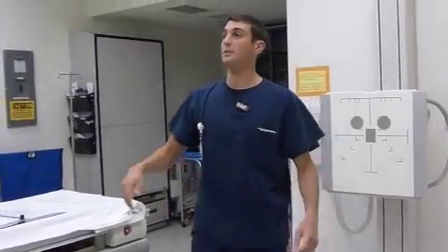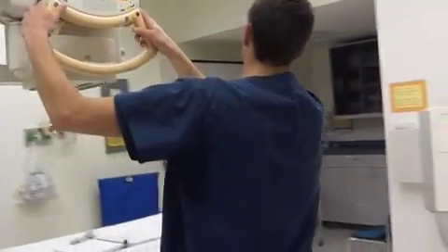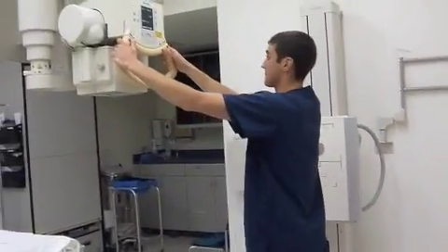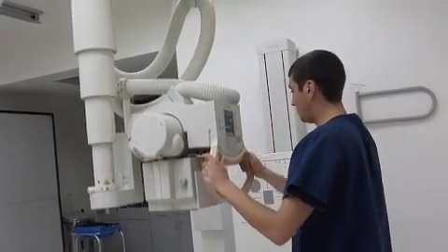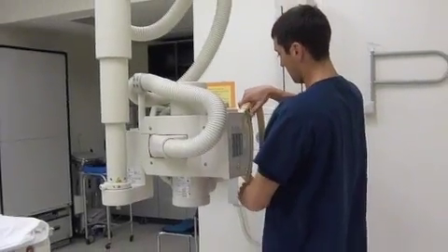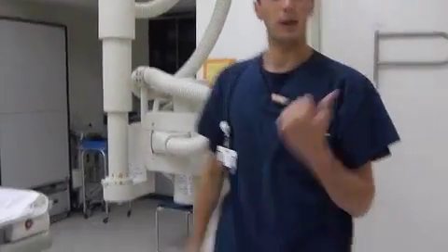And we'll now detent the tube. Have it all ready, and we'll now go and get my patient.